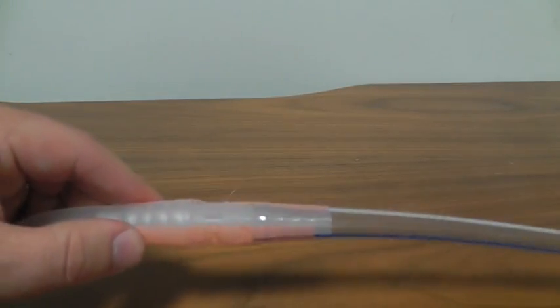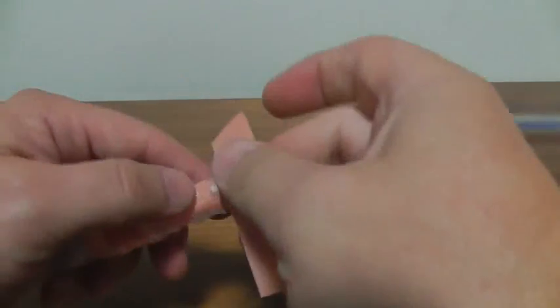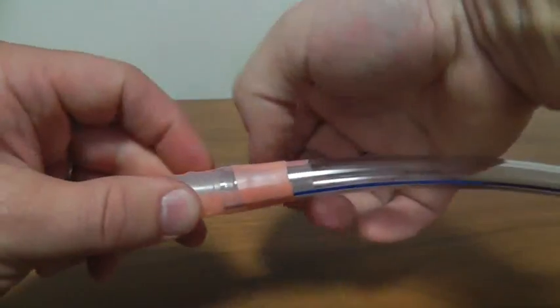What I then do, to reinforce it, is wrap another piece around one side circumferentially. That'll stop it getting pulled out from each side. And another piece circumferentially on this side.